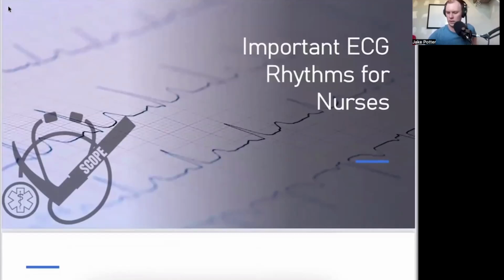All right. Welcome. This is important ECG rhythms for nurses. I came up with this idea because a friend who's a labor and delivery nurse asked me to put together a presentation on some important rhythms that nurses need to be aware of.